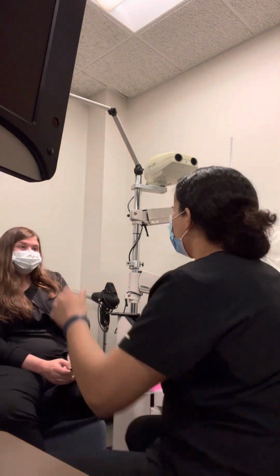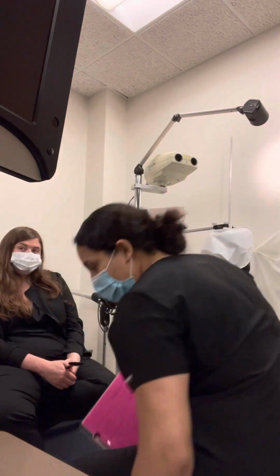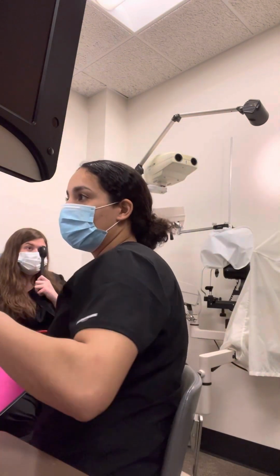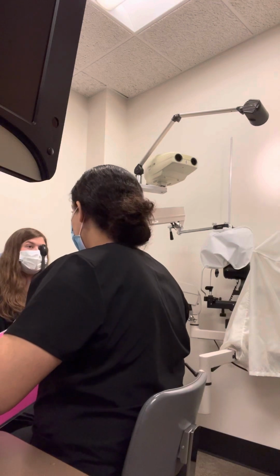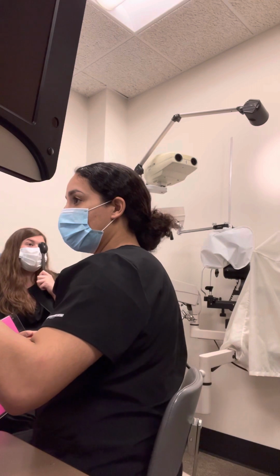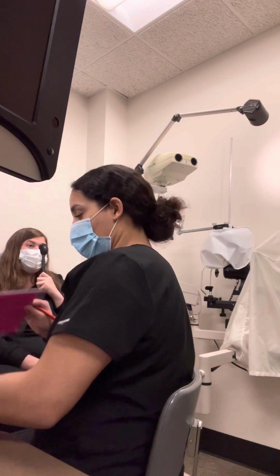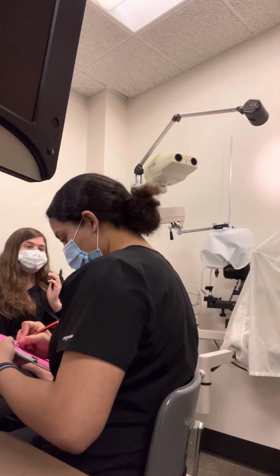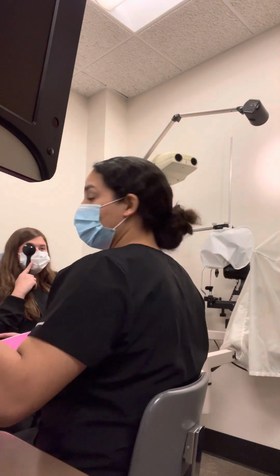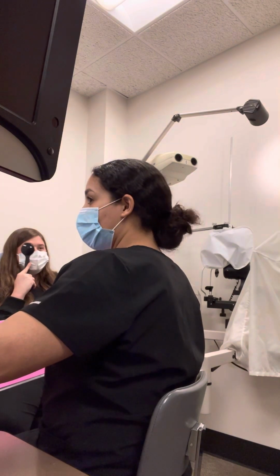Now we're gonna do your distance visual acuity without glasses on. Okay. So go ahead and cover up that left eye for me. All right. Can you read that letter for me? Yeah. Okay. What's the lowest line you can read here? PHT. Okay. Anything lower than that? No. Alright, great job. I will take that from you. Okay. Go ahead and cover up your right eye for me. What's the lowest line you can read without squinting? That was PHT. Anything lower than that?